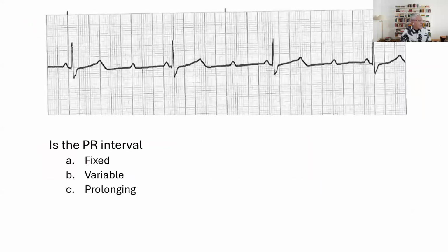All right. So there are situations wherein you will see P waves that are divorced, meaning to say that they do not have a QRS complex. Notice this: a P wave married to a QRS, that's okay. A P wave that does not have a partner.